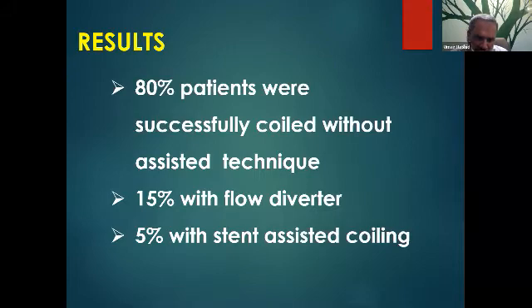In our practice, in the early days, we tried partial coiling. It was a disaster. Then we stopped doing it after a few cases. And we generally use flow diverters for large aneurysms, particularly fusiform aneurysms where we can't do anything else. So in our whole practice, there are two things which we started doing. One is simple coiling, we are still doing it. And with the new coils and all shapes coming up, it is helping us a lot.